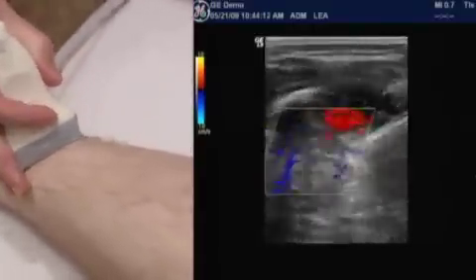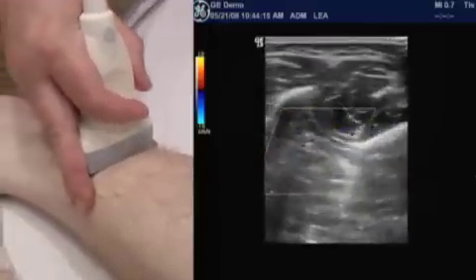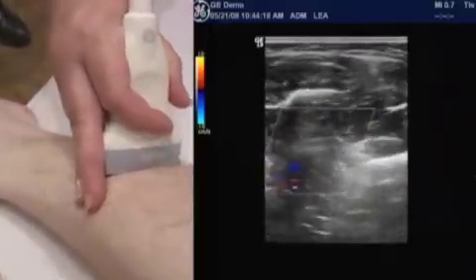I'm just going to have you relax your leg a little bit. Just relax like that. Okay. Because this usually can follow this pretty easily up. So I'm not sure if it's just a little bit. Actually, we'll have you roll back over on your back. It was actually a little bit better to follow that from that approach. And I'm just going to hold on here a little bit different.